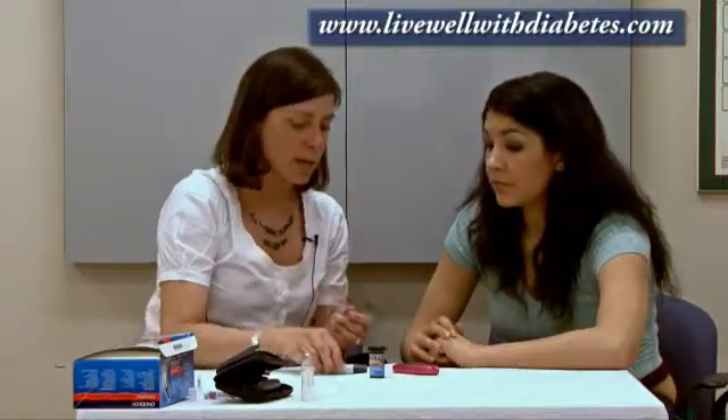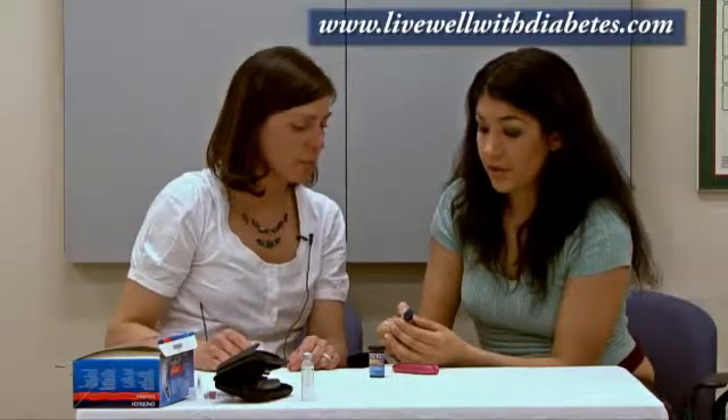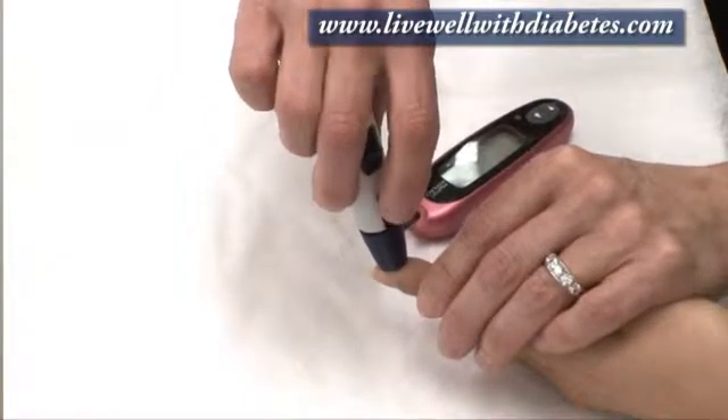When you see that drop symbol, you'd wash your hands, set the spring, and then you're ready to poke the finger. Most people find that if they put their fingertips together where the padded areas touch each other, that's mostly where the nerve endings are centered — so if you poke there, that tends to hurt more. Instead, if you poke anywhere around the edges — either side of any finger, and even your thumb — those side areas hurt less. So you go to the side, hold the lancet device gently to your fingertip, and push the blue button.